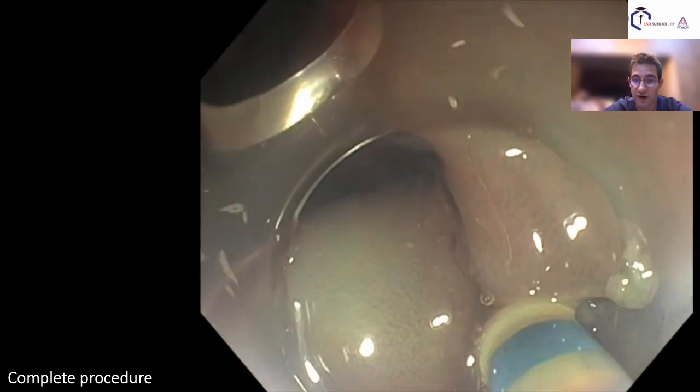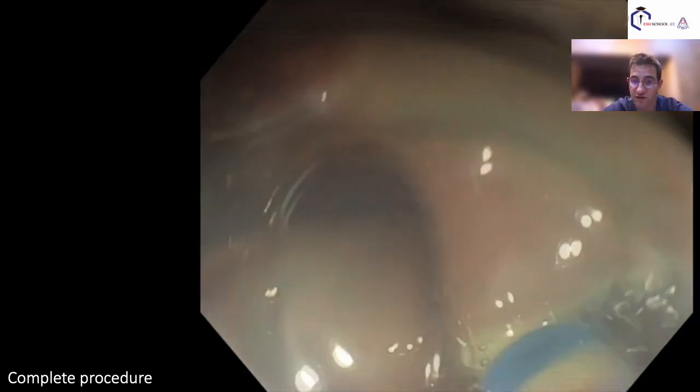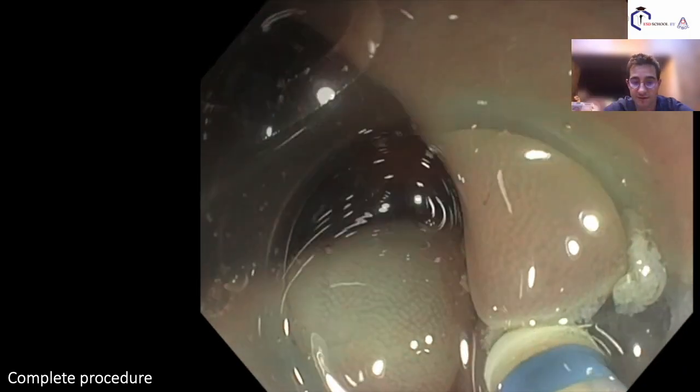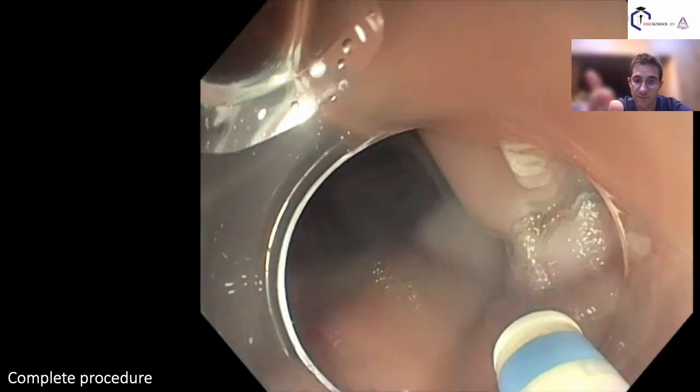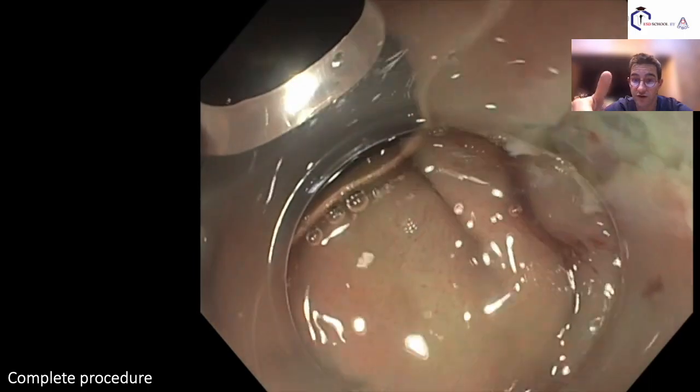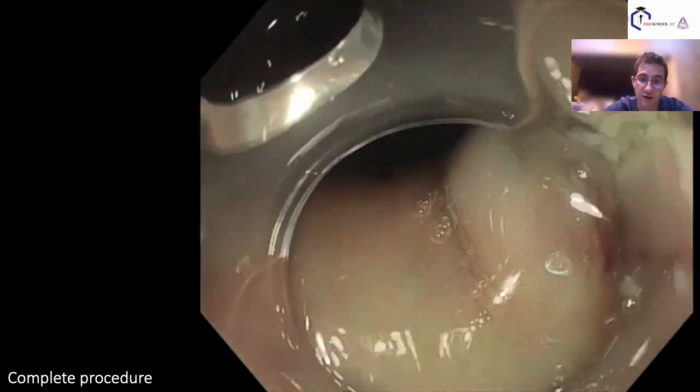When you go into a valley like this, you should inject again, because at least I try to remove the valley and make more of a hill shape, which is easier to cut than a valley where the knife has difficulty going.